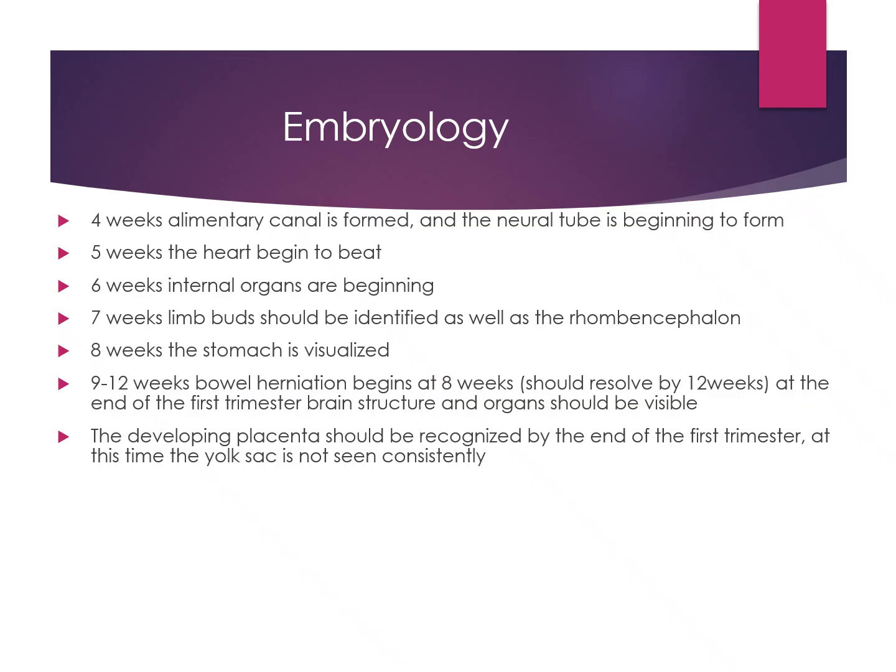Now, at the end of that 12 weeks, at the end of the first trimester, we're going to see most of those organs. We're going to see brain structures. We're going to see the stomach. And then as we enter into week 13, we have a new guest.